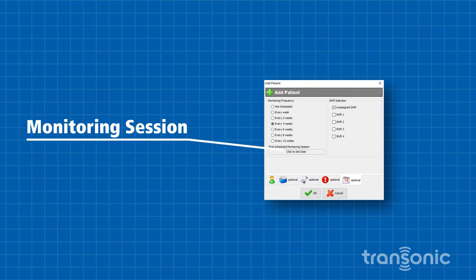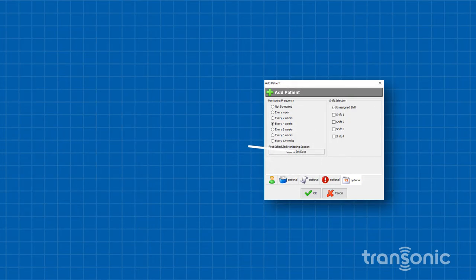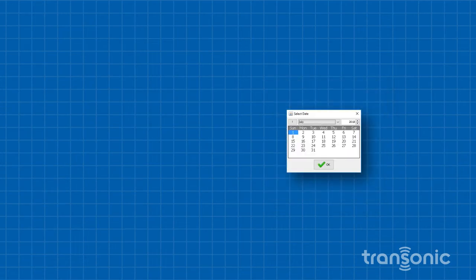Click the box under First Scheduled Monitoring Session to open a window containing a calendar. Set the date of the patient's first visit and click OK.